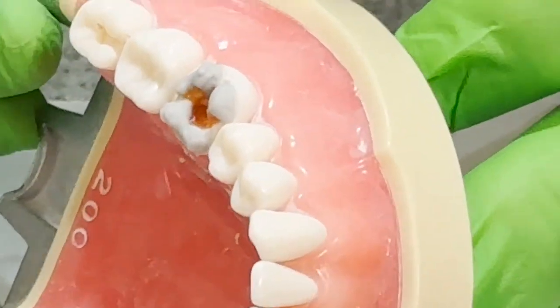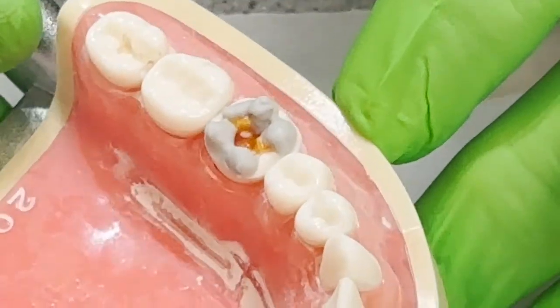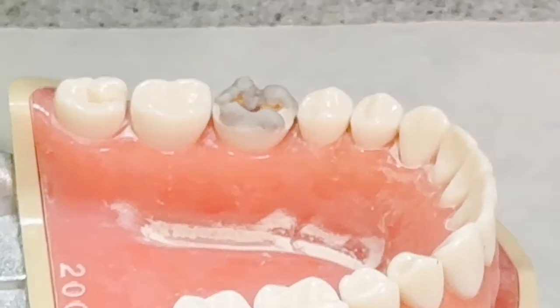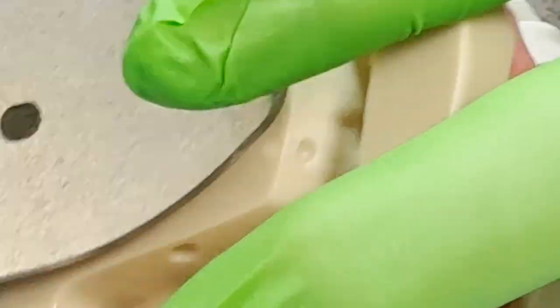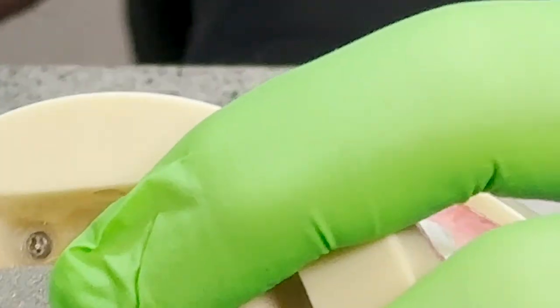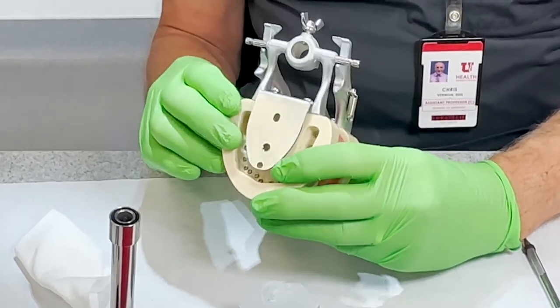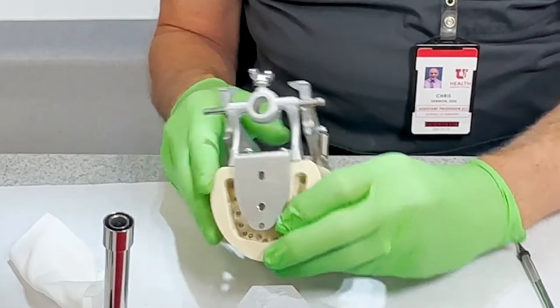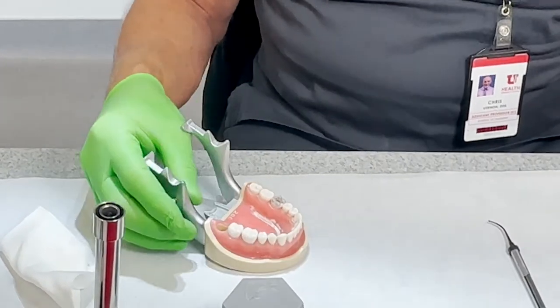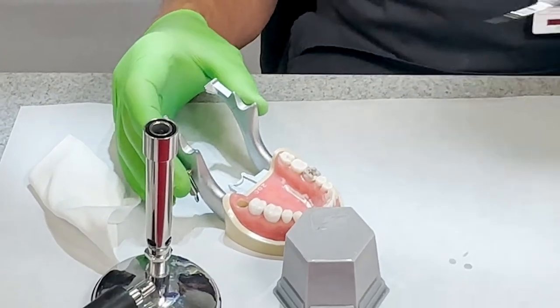Is everybody catching that idea right there? You see those cusps starting to form? Okay. Now you have to be careful you don't get too carried away. You want this in occlusion, and this is probably not the best Typodont that I can work with, but I can see right now my distal lingual cusp is probably a little kiwampus, okay? A little off, maybe a little high. So you don't want to do that and break everything. You have to be kind of careful as you do that.